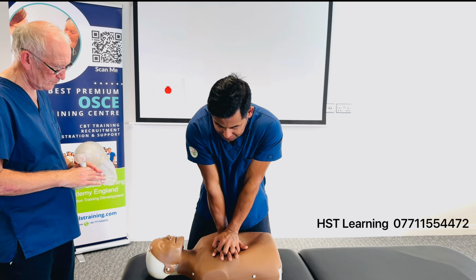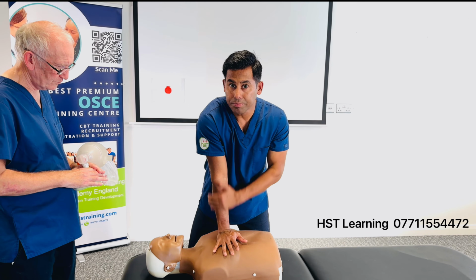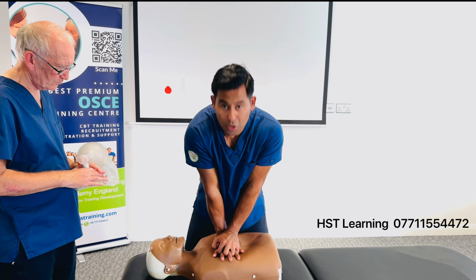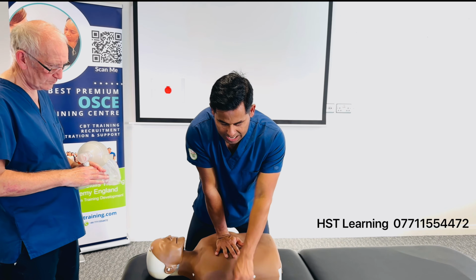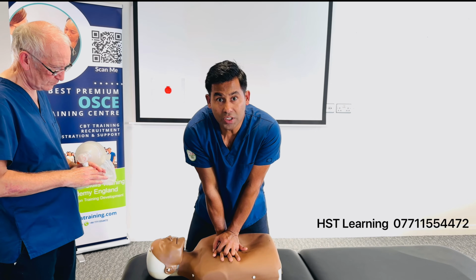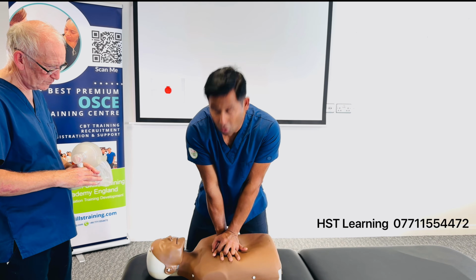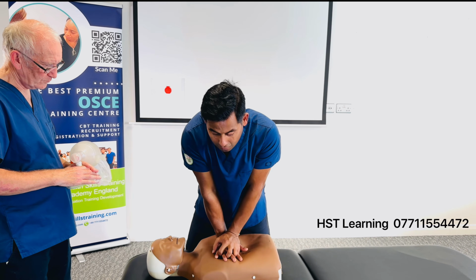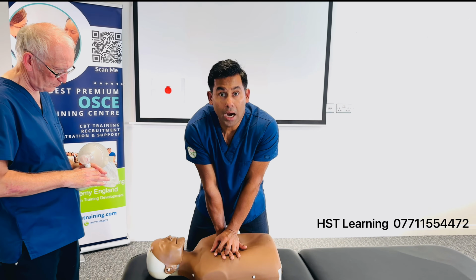So hold it there nicely and put your body weight on. Make sure your arm is straight. Don't bend it. Arm is straight and make sure you put the body weight on the dummy. Can you see it? I'm leaning over and my nose is pointing in front, and I have already compressed about 2 to 3 centimeters before I even started the compression. How has that happened? Because I am using my upper body weight. The head is normally heavy, so leaning forward means I don't get too tired when I do the compression. I use my upper body weight.